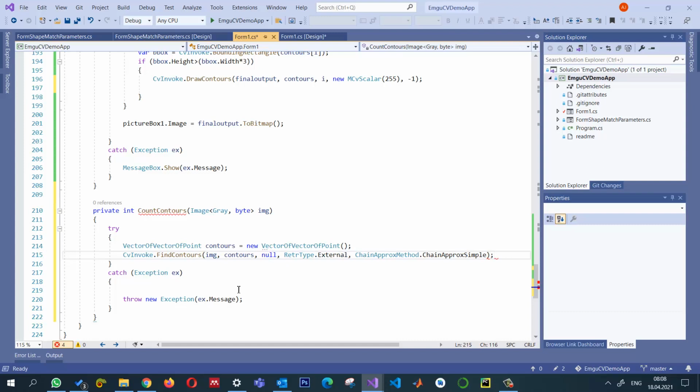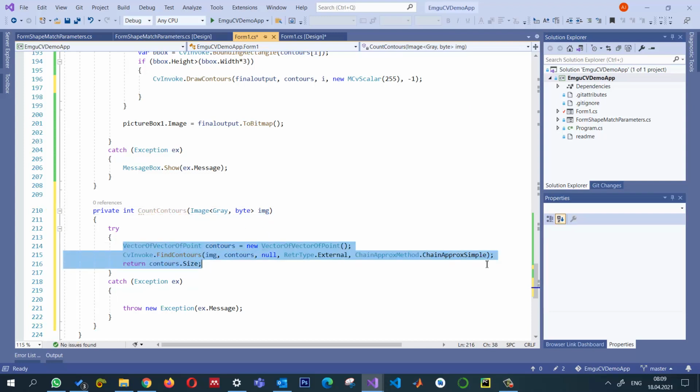And now once we have the contours, we just need to count them and return that. So contours.Size. This is what exactly I just want to return. So we give an image, we find the contours for that image, and then we return it. But what will be this image exactly? It will be the image of the contour itself only, I mean the white area. So this is very important.